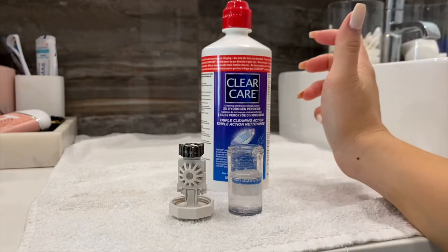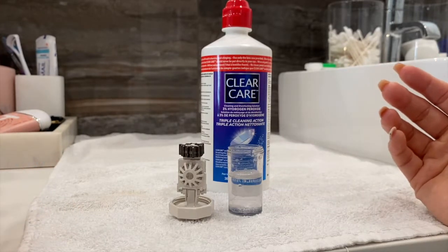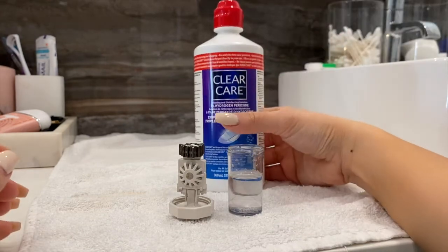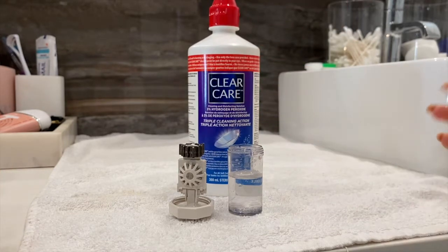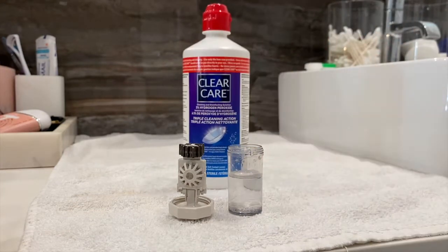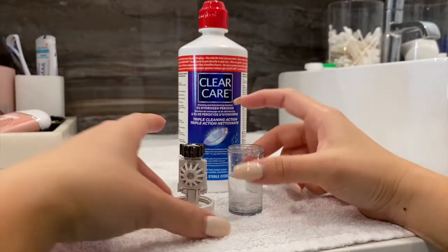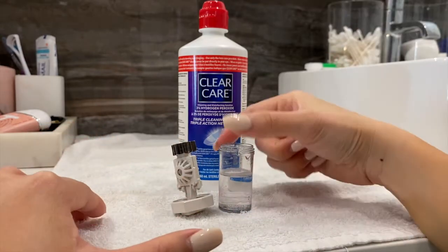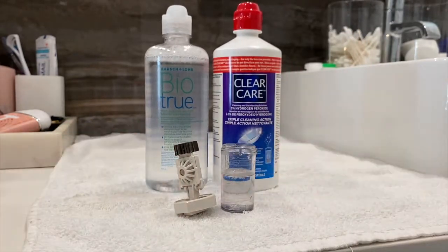This cleaning system does all the work for you, so you don't have to scrub anything. If your bi-weekly lenses are only lasting a week and a half, try this system — residue and dirt clinging to the lens makes them uncomfortable. This really helps a lot of my patients who have residue buildup during the day. I use this every night, and the next day you put on a clean lens. These are the two solutions I use.